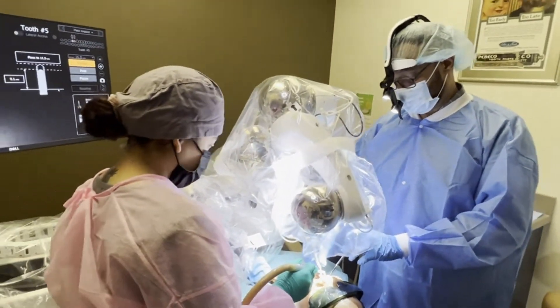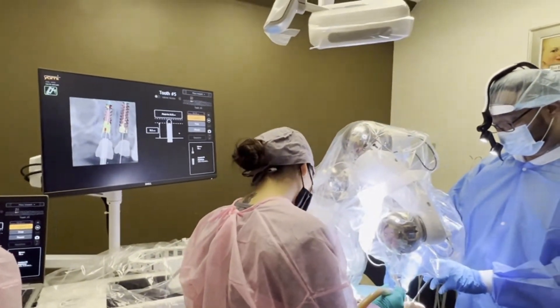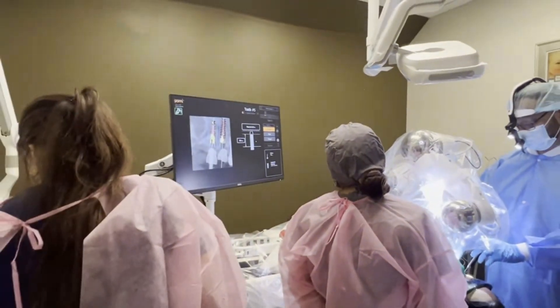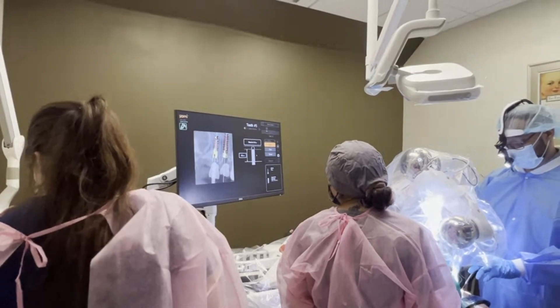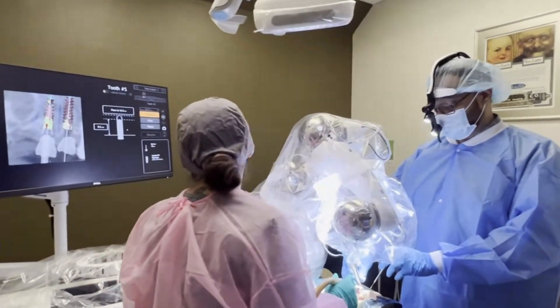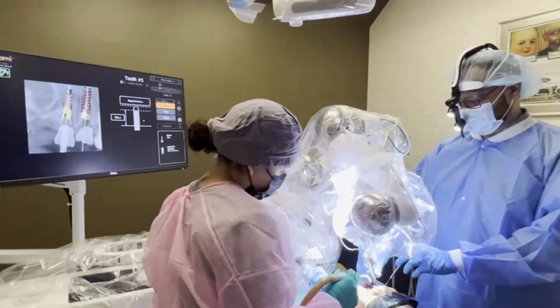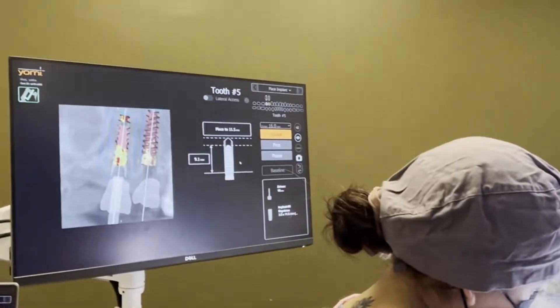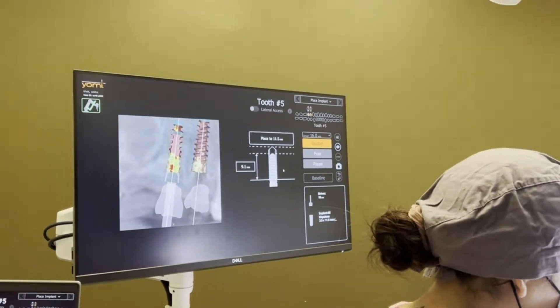Can you change it to 25 please? Ok. 25 — and I'm over here, so just like we normally used to do. When the bone is too soft, we decrease the torque. That's what I'm doing now — I have stopped my handpiece and instructed my assistant to change the torque to 25, and I'm going to proceed as usual.